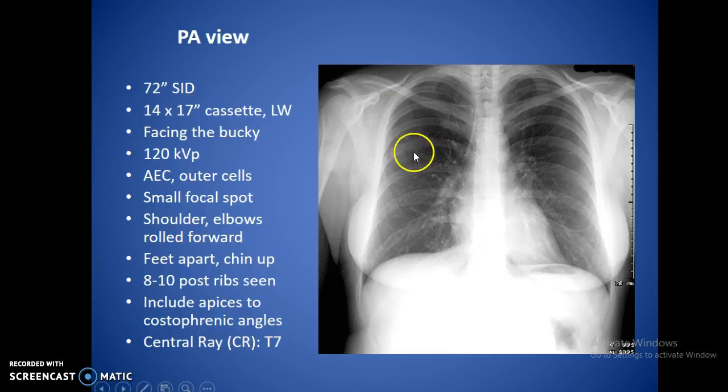And we'll get into that in basic radiology. But it's going to put the cell basically one here over this part of the lung, the other one right here over this part, which is all over air, so it should give us a nice consistent look so that we don't make this image too dark, and we can see all the fine anatomy within the lung field.